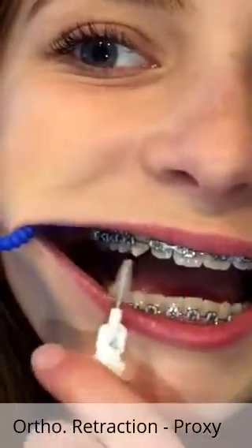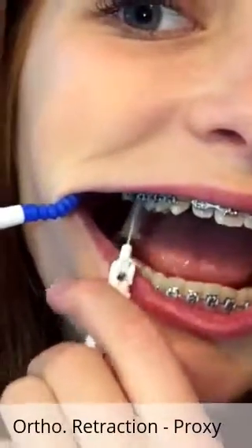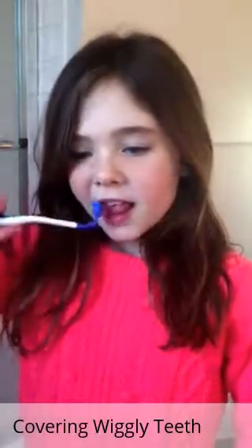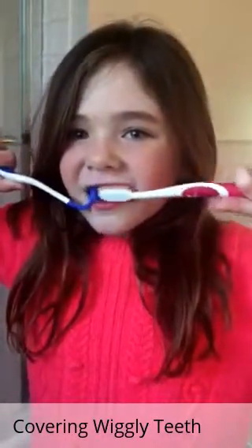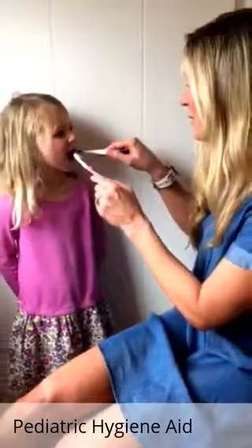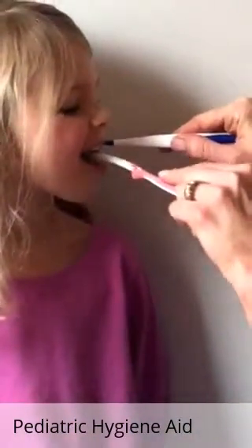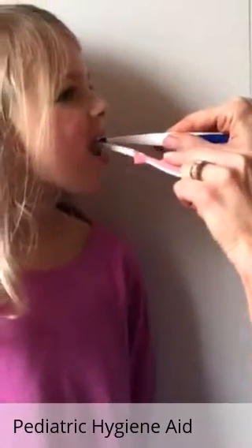She can really get in there nicely with that proxy brush — kids have a hard time reaching those. Mouth mate really acts as a retraction tool so the mom or dad can retract that area and really see better in that mouth.